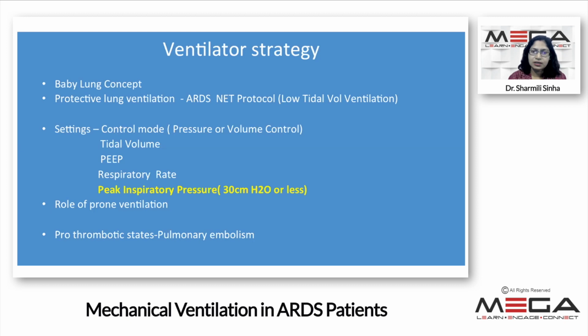So you usually set a control mode, either pressure or volume control. As Dr. Ranajit very nicely explained, you can set the control mode in either the volume or the pressure mode. Both ways are possible. It is not only volume, neither only pressure. Both can be utilized for this purpose.